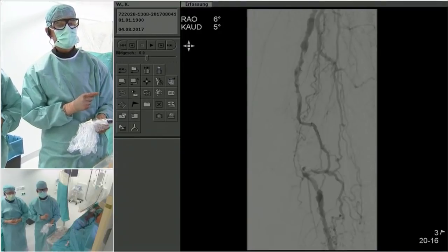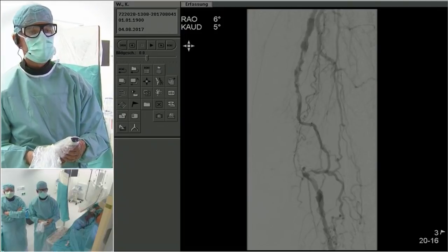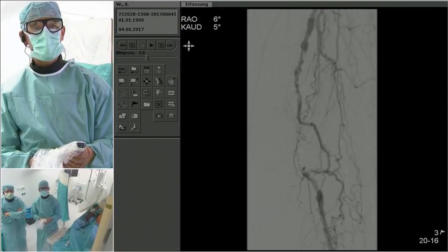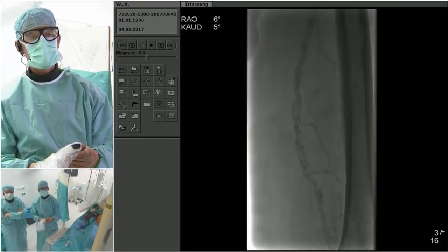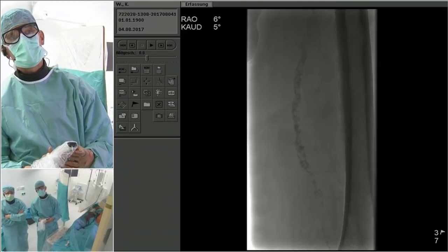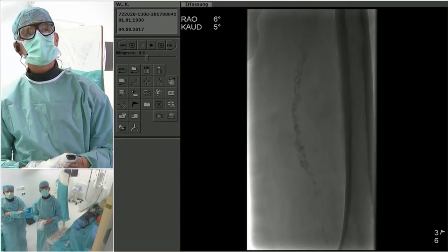Okay. Here, so can you see the angio? Yes, we can, Andrej. Yeah, perfect. So this is once again the SFA total occlusion, mid portion. At the end it's not too long, but as you have seen, it is really extremely calcified. And yeah, what do you think? I mean, while you prepare your steps, filled with concrete.